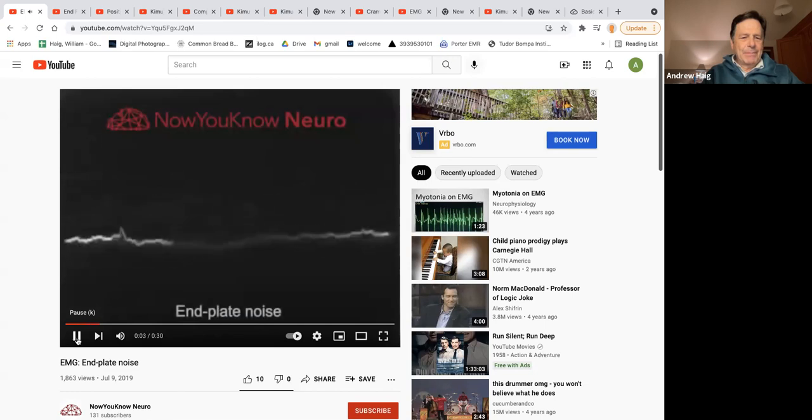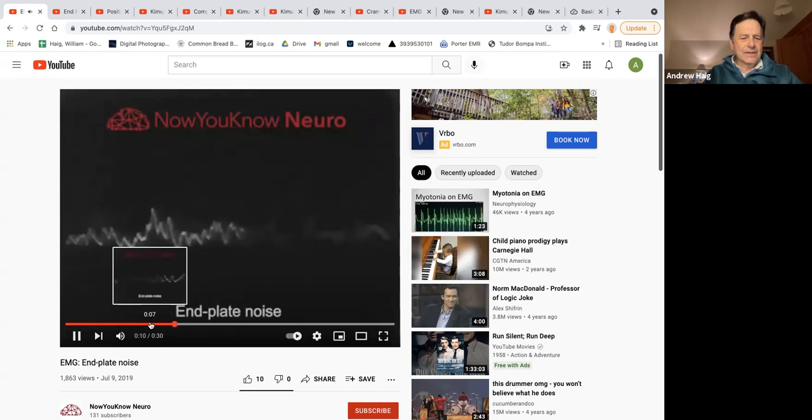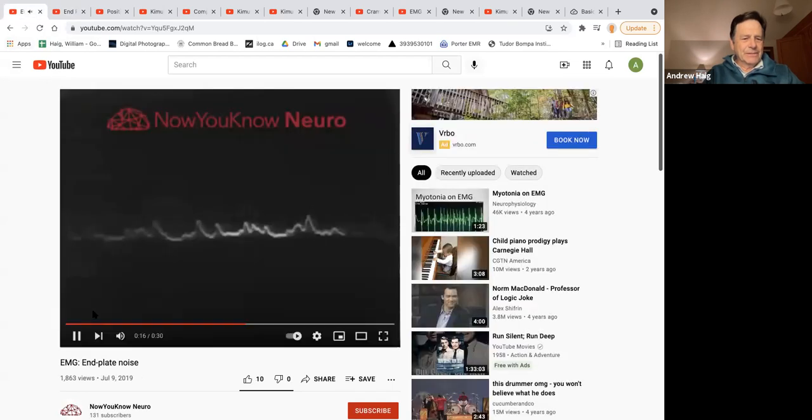It's not the pop, pop, pop. It's the shh in the background. Pretty subtle. Okay? Pretty subtle. You're right here in end plate. Okay? So if you go back to the beginning of this, you don't hear that. You go out here. That's, okay? That's another one. You're going to stop the end plate. Stop.